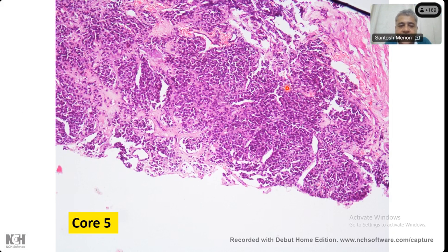So GATA3 is a marker for urothelial. Again, not all will come positive, so you may like to do a panel. Remember, prostate cancer does not express CK5/6, HMWCK, P40, but a urothelial will generally express some of these markers like P40, CK5/6 and HMWCK. So a panel of GATA3, HMWCK and prostatic markers like NKX3.1 and PSA IHC will help you distinguish a prostate from a urothelial.